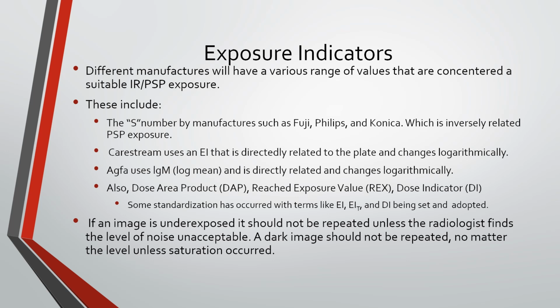Those areas we would consider saturated, and we'd probably want to repeat those, even though we used a very high technique, which the patient was now exposed to unnecessarily. So this is our role. This is our job with technique. Further discussion of exposure indicators is delved into in the advanced topics of radiology playlist on this channel.